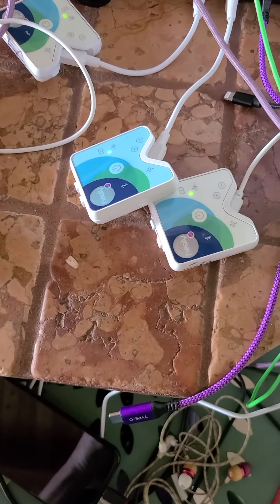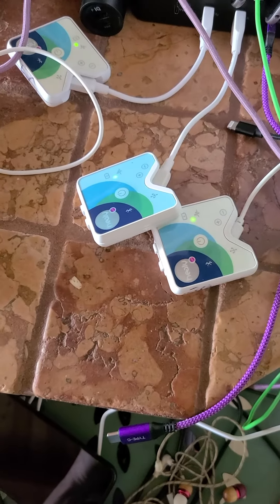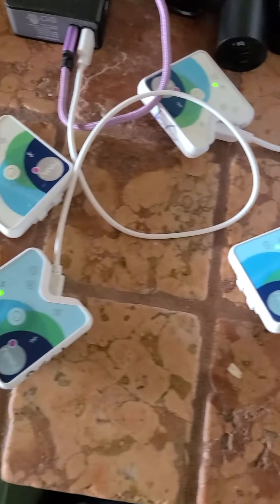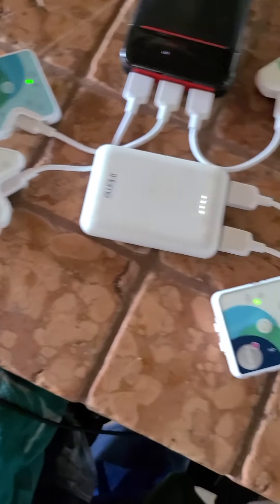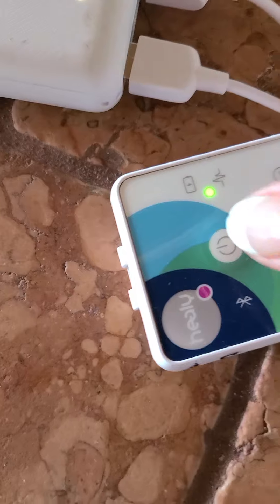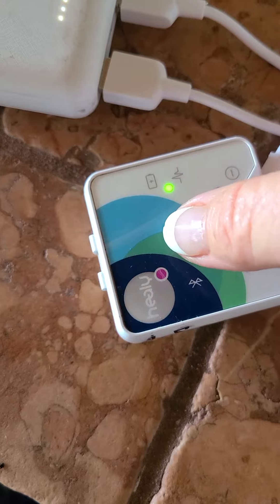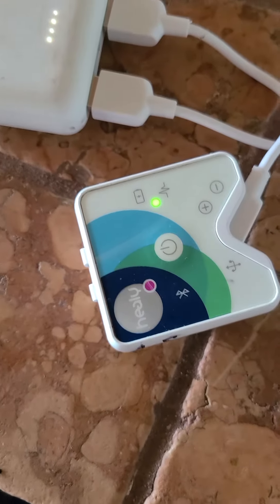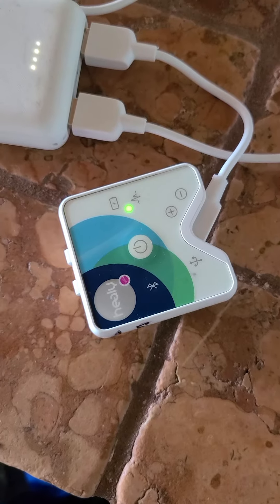Something I learned today in my training session is that every once in a while you should do a hard reset on your Healy when it's off. You push that button when the green light is not on and hold it for about 20 seconds until the green light goes on and stays on. Then you take your thumb off and wait until the green light goes off. Then you charge it fully until it's done.